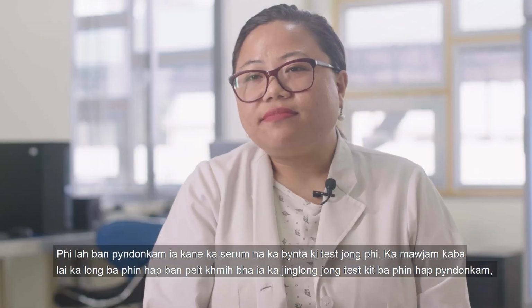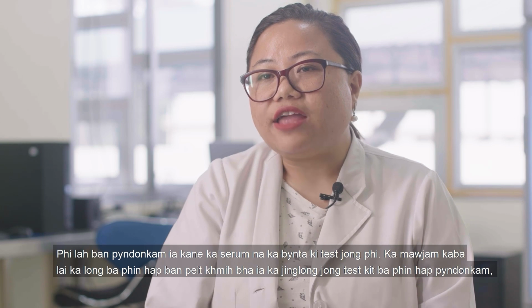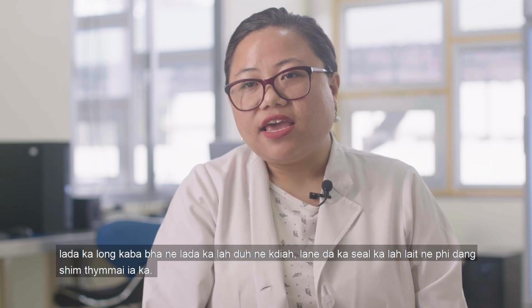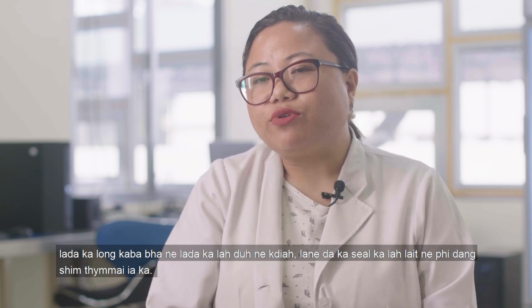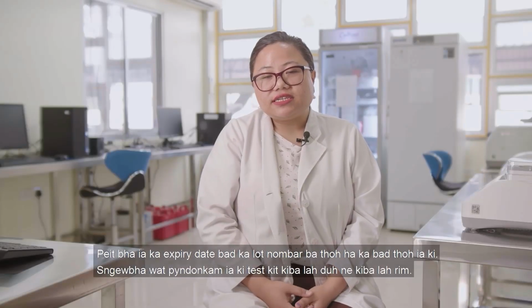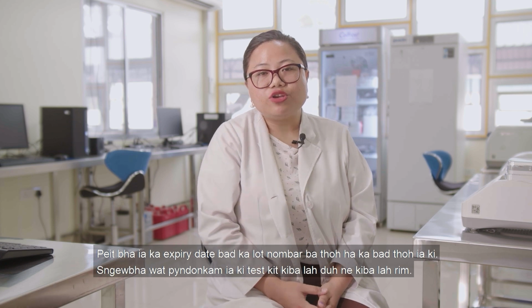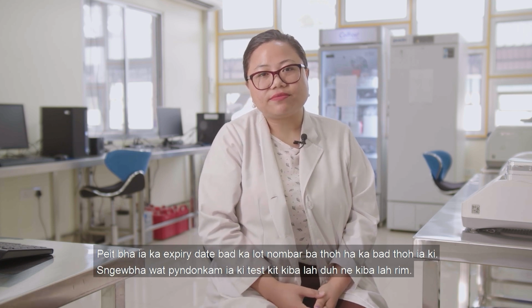The third step is you look at your test kit box that you're going to use, and you look at the integrity of that box, whether it's broken or the seal is broken if you have taken it out newly. You're going to look at the expiry date and the lot number. Note it down. Please do not use any expired kits.